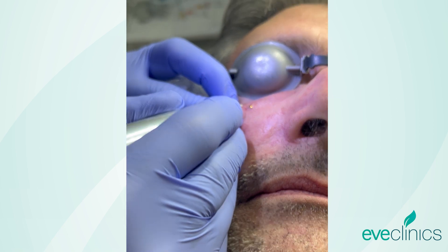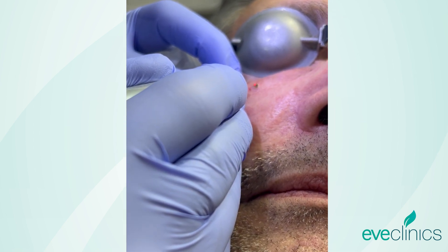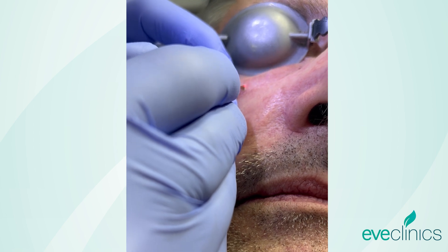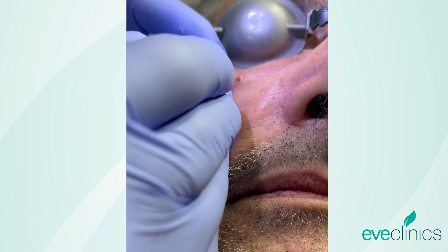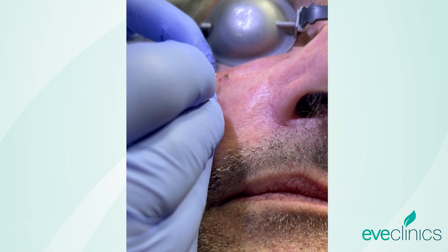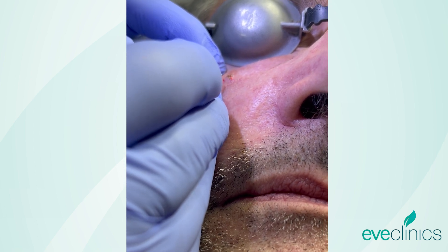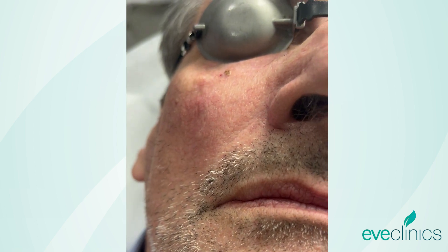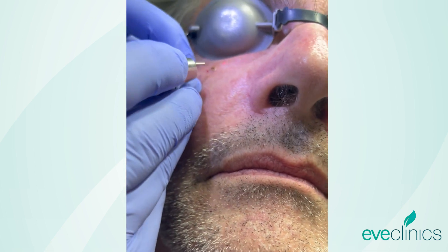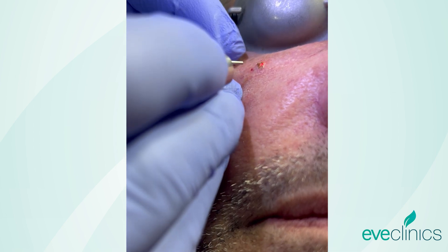And just strip the lesion down to the healthier tissue beneath — you can start to see it appear now. As we're getting to the base of this, we just lower the power a little, to be a little bit more precise.